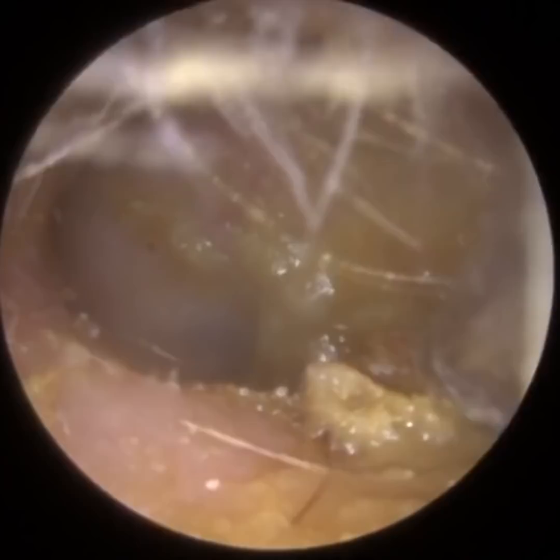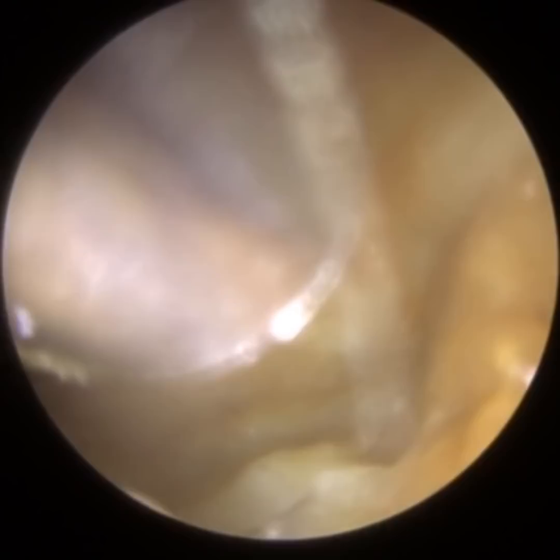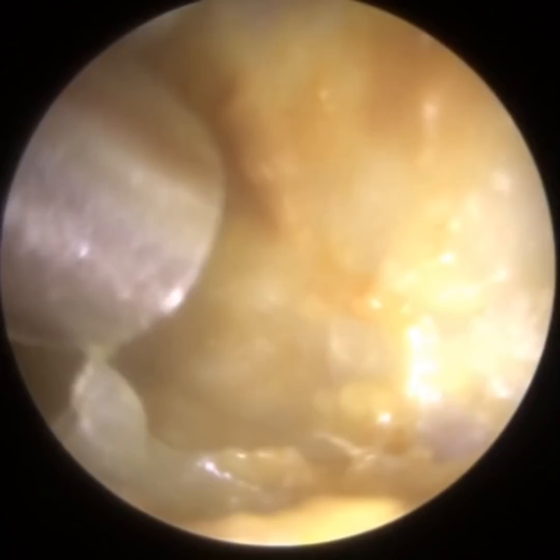You'll have a better view in a moment. While you're watching this, I'm going to go through some Q&As from the last two videos. At the bottom you can see that dead skin — it's a collection of oil — and I'm just going to mop it up using suction. We're going to use a fine Zoellner gauge in a moment to remove this delicately off the eardrum and the ear canal wall.